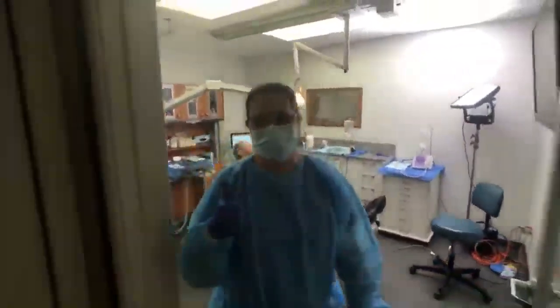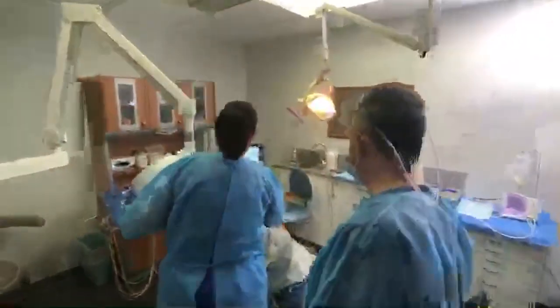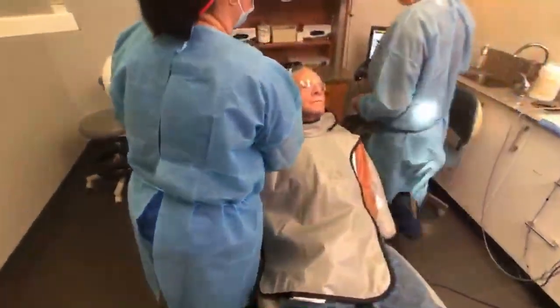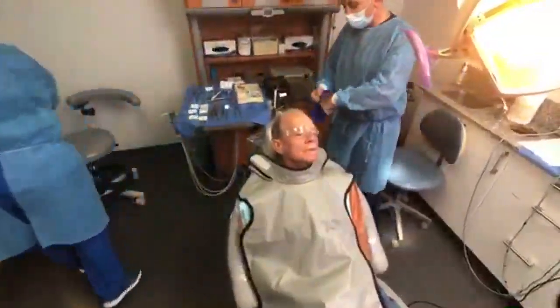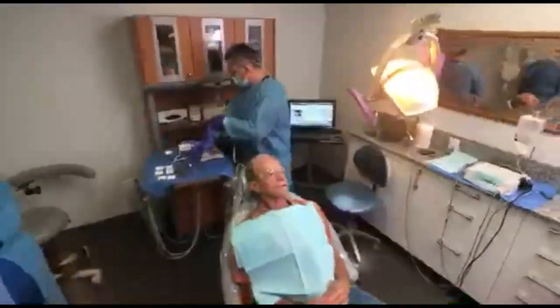So why does she take this x-ray? It's called the guide pin — it shows us exactly where the implant is going to be placed. It shows me exactly where I am in the bone. The implant is spot on, meaning it's positioned exactly where the root was and we're avoiding adjacent roots completely, so we have a parallel implant to the adjacent root.